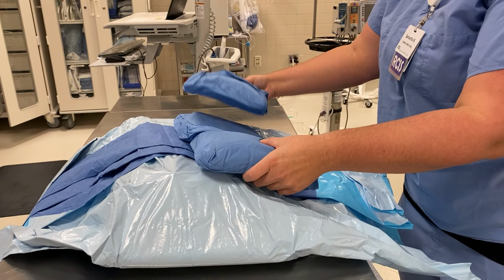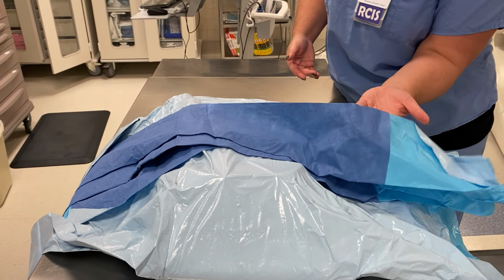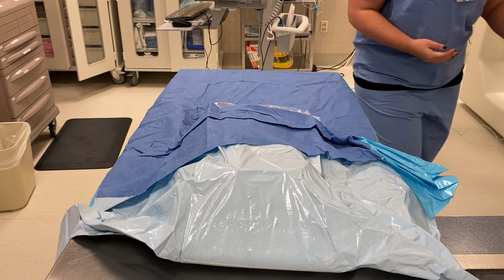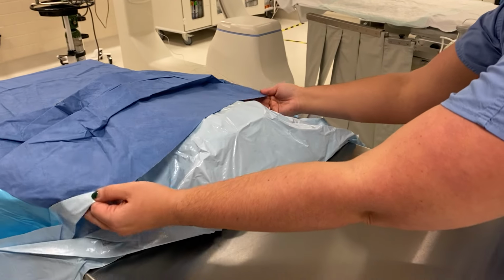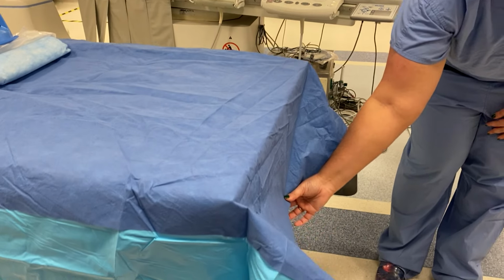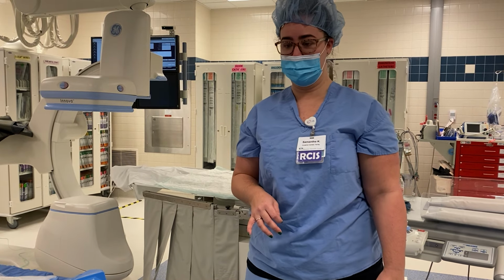The next thing, we'll take our 3 gowns and we'll set them aside, and we're going to open our table. So I'm going to reach underneath here, and I'm just going to pull away and down and pull it nice and taut. And then I'll come around to this side and pull again. And you'll notice that I'm not reaching over any of the sterile areas, so I'm not contaminating anything. Now everything that is off the edge of the table, like everything down here, is now considered to be dirty. So that's okay to touch. Anything that's on the top of the table is sterile, and we should not touch it without sterile gloves.